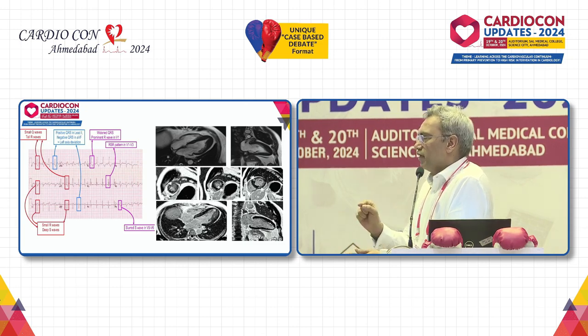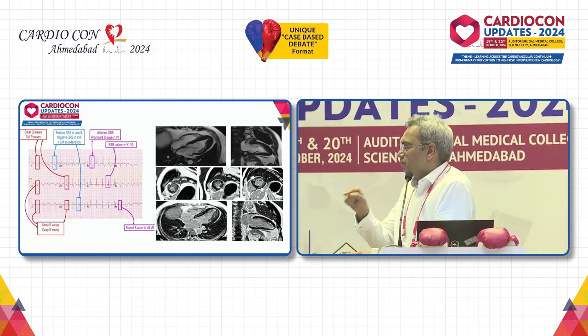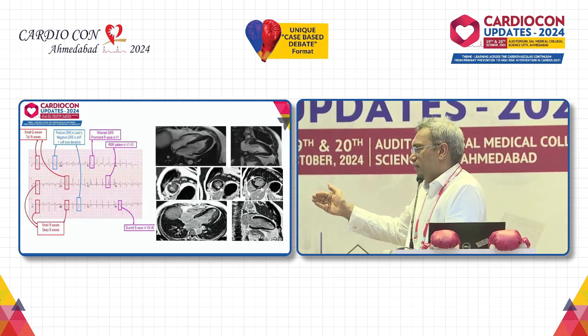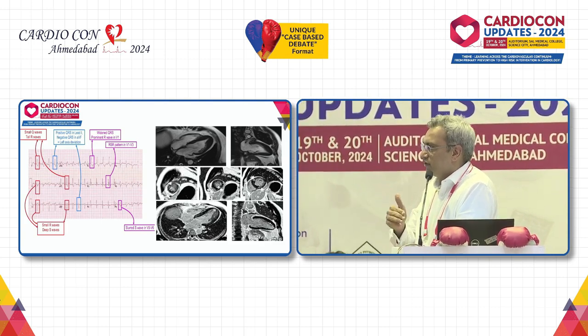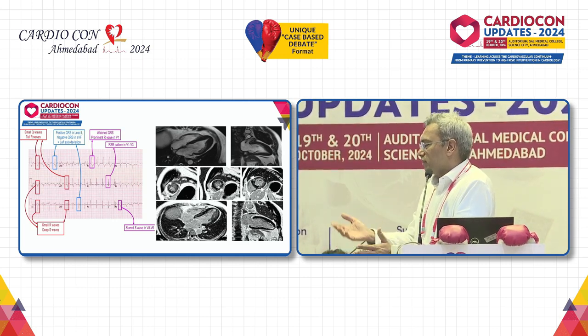This patient has only apical scar. There is healthy septum, recanalized LAD, and I don't see any reason to withhold conduction system pacing from this patient. Second thing, I would still consider this patient has a conduction disease in addition to the anteroseptal MI, previous MI. I don't think this MI has led to conduction disease itself, because any MI that produces a conduction disease, I think there has to be some septal scarring. That is what I mentioned.